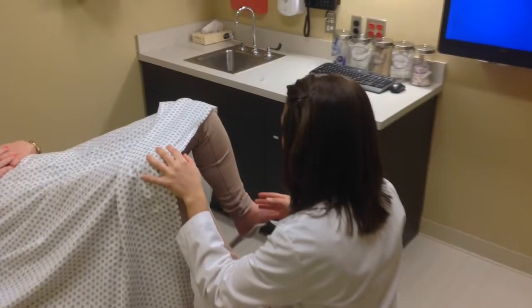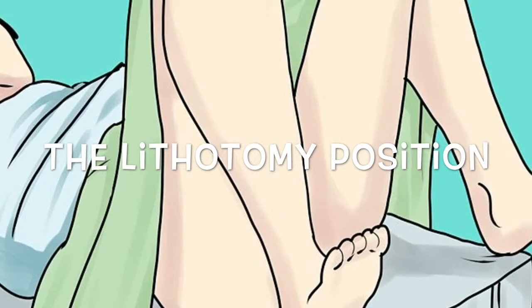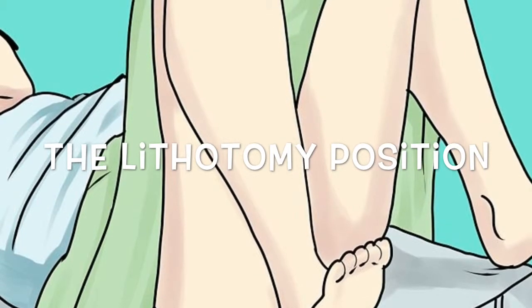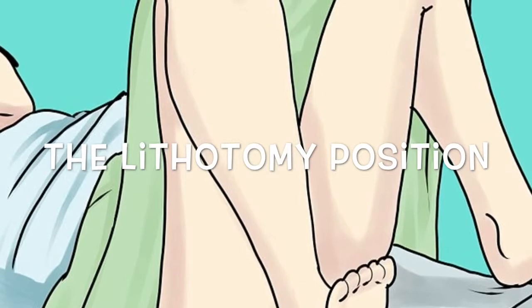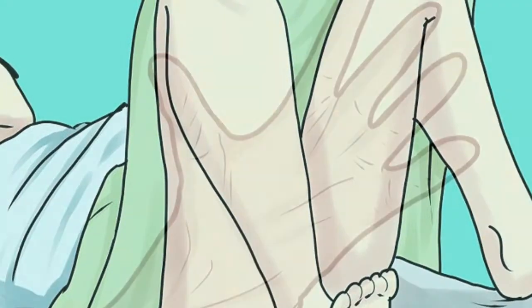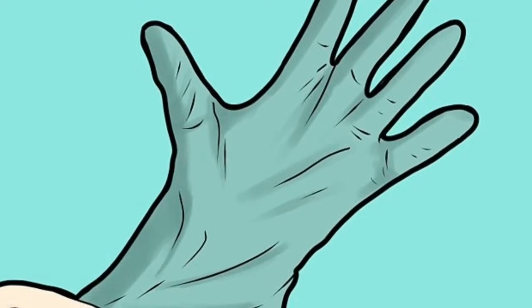Now that we've reviewed all necessary equipment, we can go over the procedure step by step. Place the patient in the supine position with the legs abducted. This is otherwise known as the dorsal lithotomy position. Position the sterile fenestrated drape around the patient's genitalia at this time. Remember to use strict sterile technique for the insertion process. Now would be an appropriate time to put your gloves on.